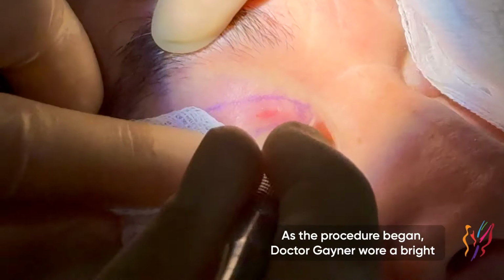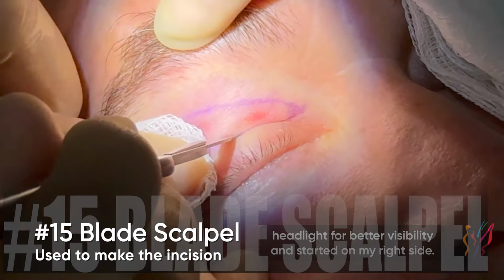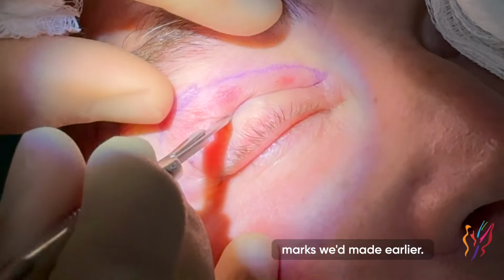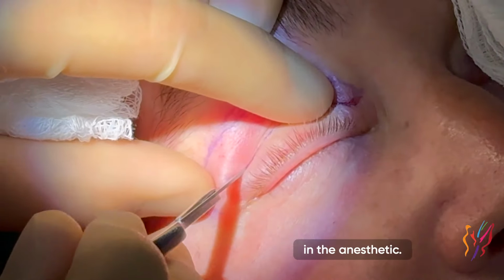As the procedure began, Dr. Gayner wore a bright headlight for better visibility and started on my right side. He used a number 15 blade scalpel to make the incision along the marks we'd made earlier. There was minimal bleeding, thanks to the epinephrine and the anesthetic.